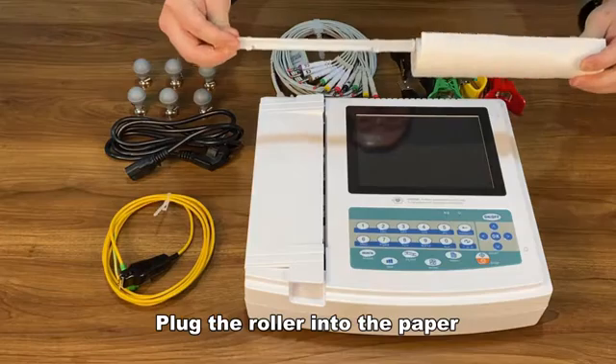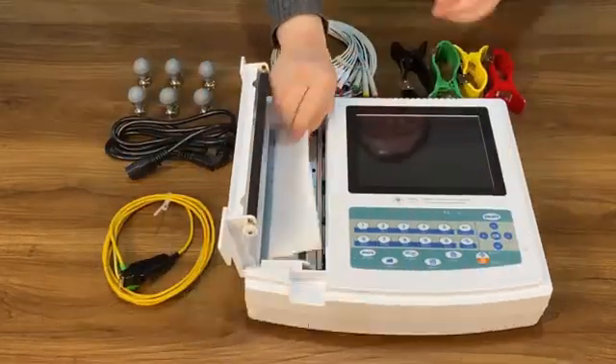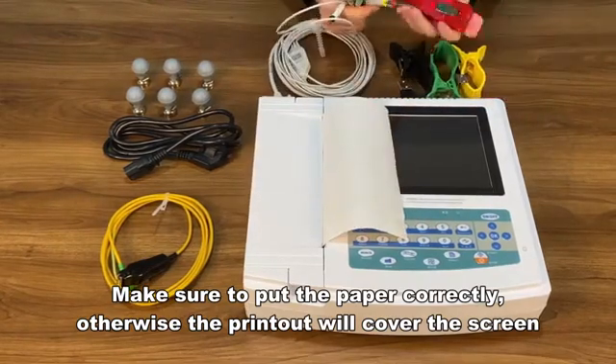Plug the roller into the paper, open the printer cover, and put the paper into the printer. Make sure to put the paper in correctly, otherwise the printout will cover the screen.